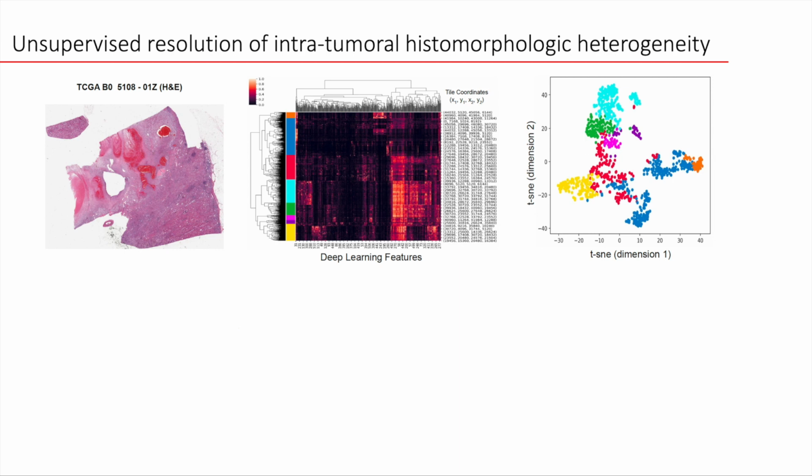These images are run through that neural network. We collect these feature representations in that penultimate layer, quantify them, and instead of trying to classify them, we can instead cluster them using hierarchical clustering or t-SNE approaches. And you can see that there is at least some clustering of the different tiles of this image into specific subgroups and areas on these dimensionality reduction plots.